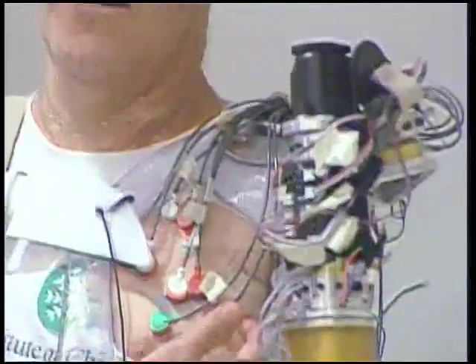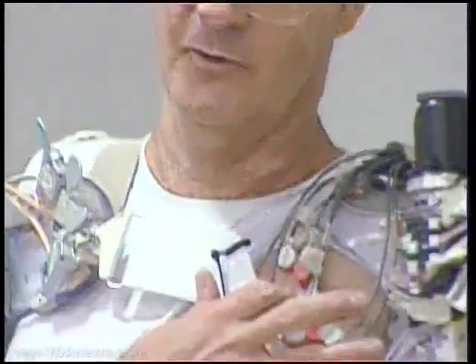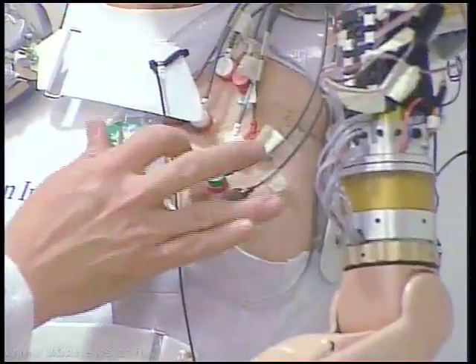You're touching me at the elbow on the top side of the arm. How about over here? That's right in between the finger and the thumb on the back side of the hand.